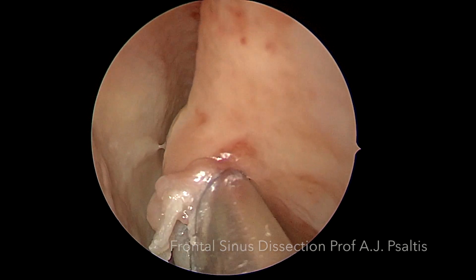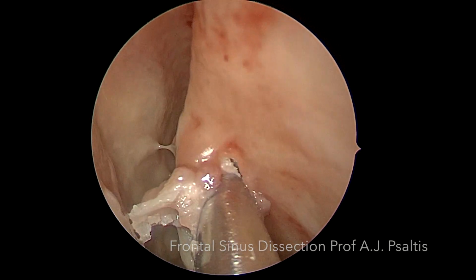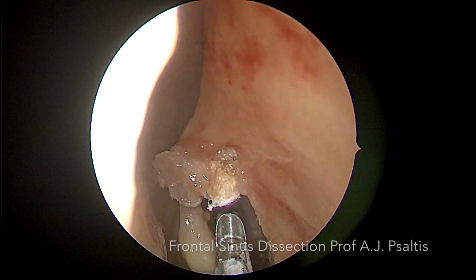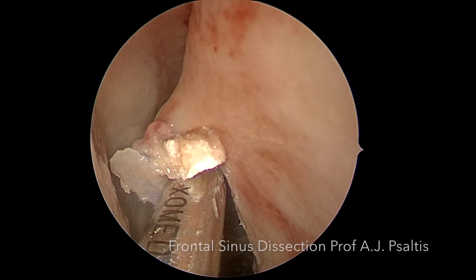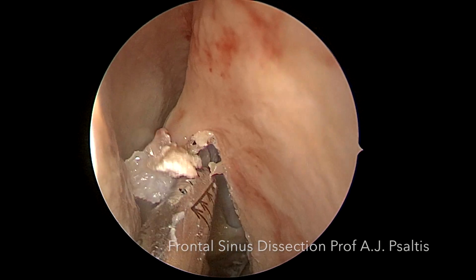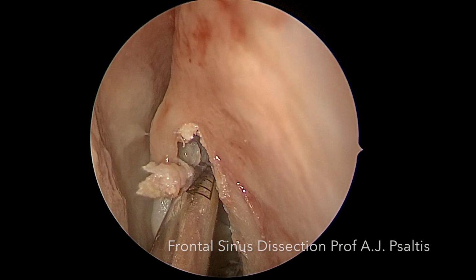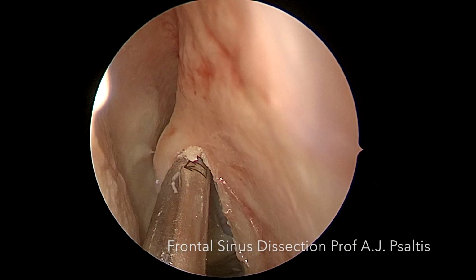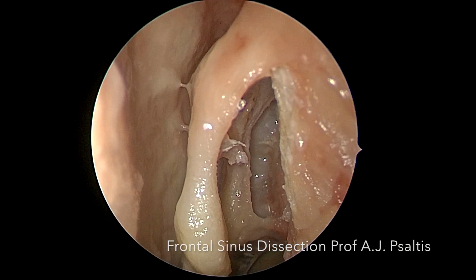By taking this up as high as you can, you create direct access to the frontal sinus and allow visualization with a 0-degree scope for much longer. Here we are using an angled shaver burr, a RAD 60, to remove the mucosa and the bone that has been dissected away. We now have full exposure of the agger nasi cell using a 0-degree endoscope.